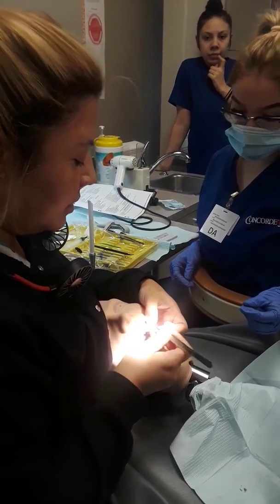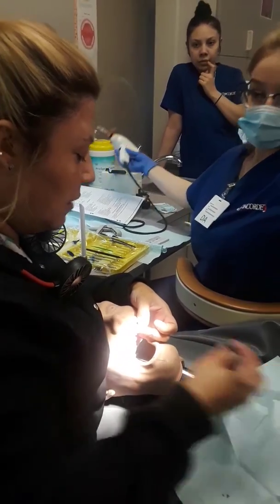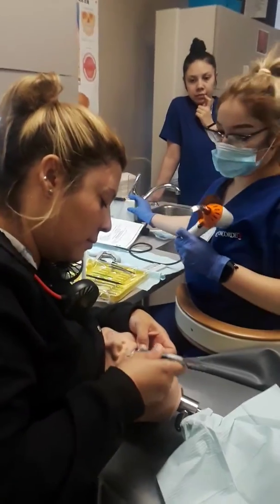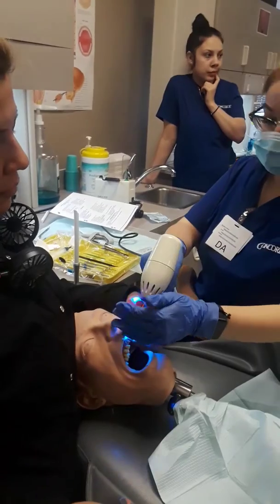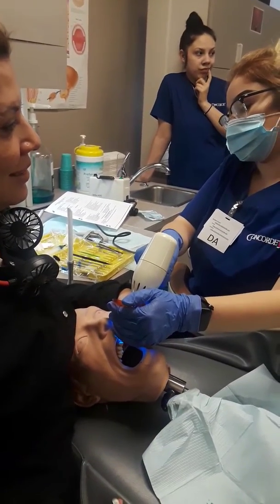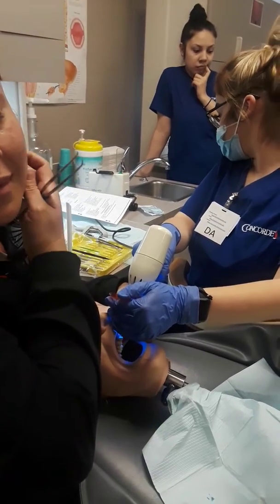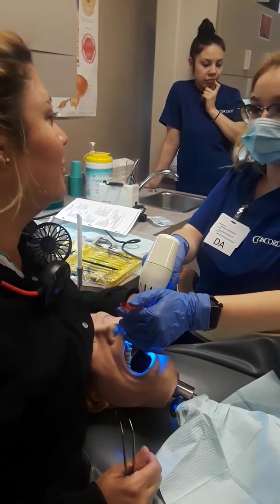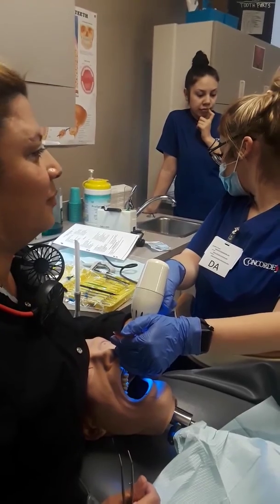Can we cure again? Since it's still soft it'll come off with the matrix. Cure this time for the full 20 seconds so it stays.